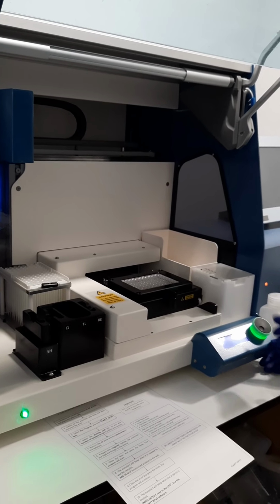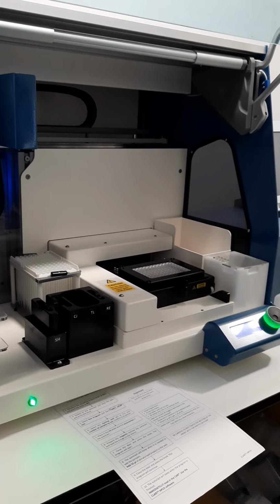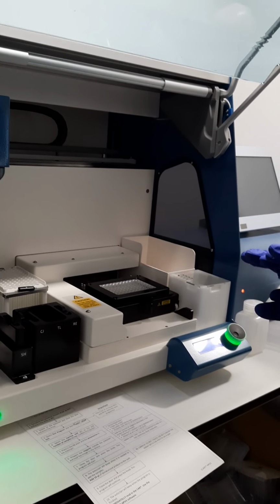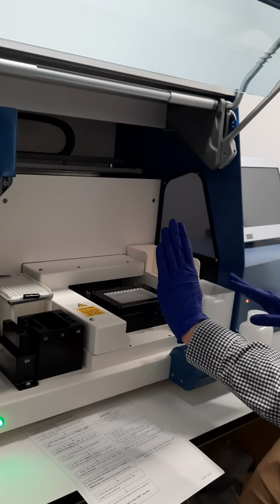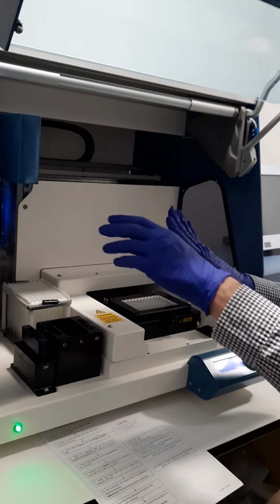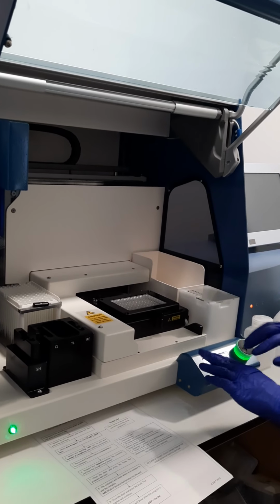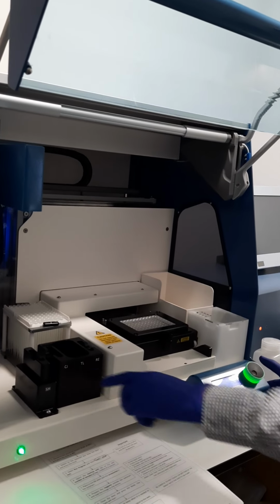Okay. So next step, add the CJ reagent, which is the conjugate. The conjugate is a molecule of streptavidin that is bound to an enzyme. As the primers are biotinylated, the DNA is going to hybridize with the probes, and then we are going to add the conjugate that is going to bind to this biotin, and we are going to immobilize this enzyme, okay, and finally the development solution that is a substrate of this enzyme.